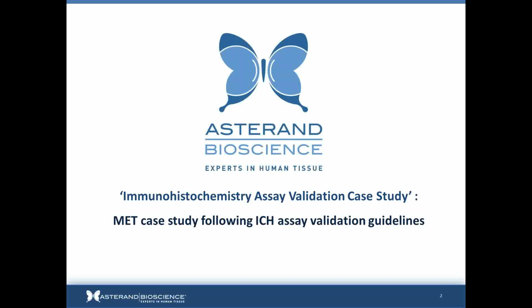Assay validation follows guidelines set out in the Validation of Analytical Procedures document, and it usually requires quantitation. And while quantitative immunohistochemistry is regularly performed, relative measures, optical density and others, are frequently used. The case study I'll be presenting builds on what is run in quantitative IHC and takes us towards a prototype immunohistochemical standard curve, converting classical brown staining into more quantifiably meaningful data.